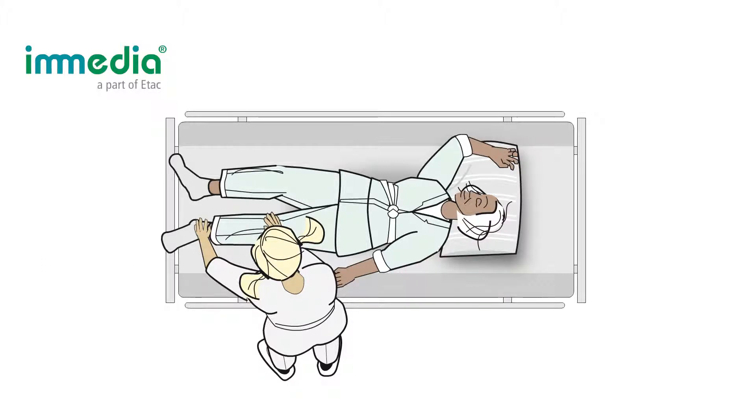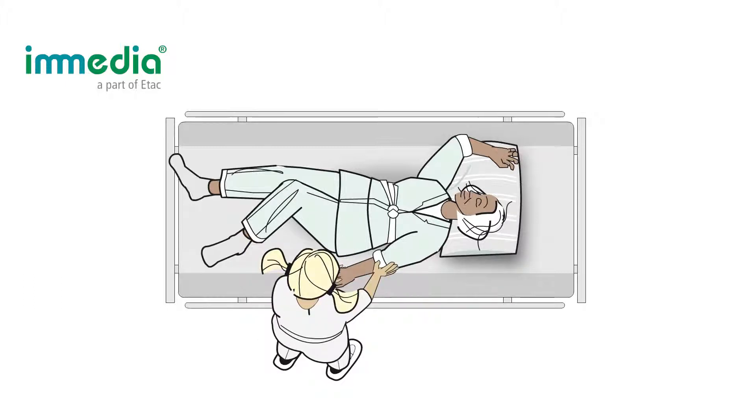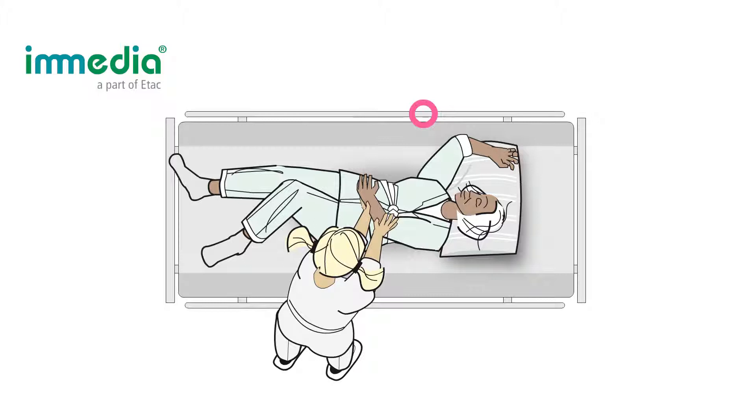Ask the user to bend her left knee and assist the user if needed. If possible, ask the user to cross the arm toward the opposite side. Assist the patient if she needs help.